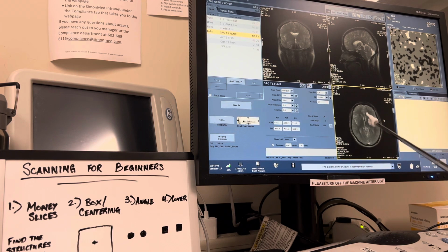It's the lateral ventricles. This is the falx cerebri. This is our money slice too. So basically, we have this mohawk on the inside of our head that courses this way. Okay, it does not go right through the middle. So we could see it only on the top right here, because that would be right here. These are the lateral ventricles, this brighter portion right here in the middle, right under the corpus over here. These are those same lateral ventricles.